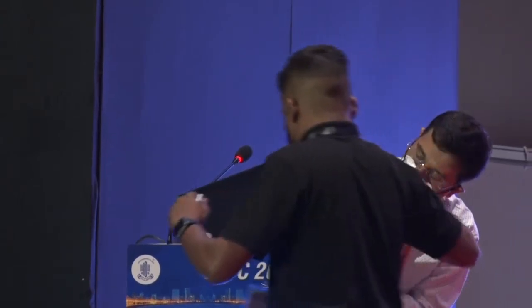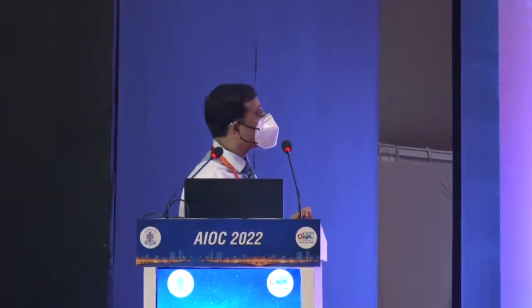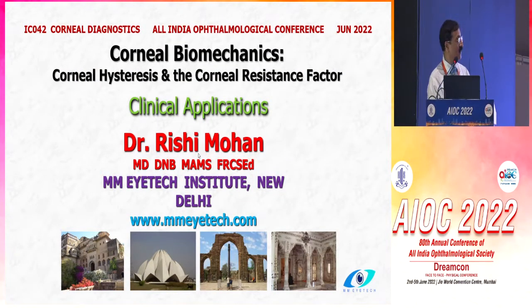I would be happy to take any questions till Dr. Rishi Mohan is getting underway. How many plan to buy the Itrace after this talk? Itrace is a beautiful device. You use it for all your cataract patients now, without exception, or only for the premium?